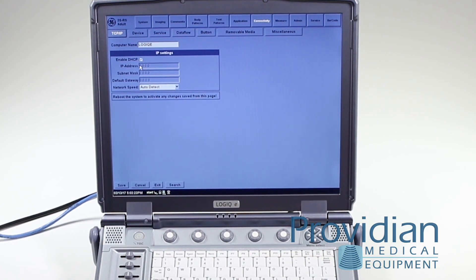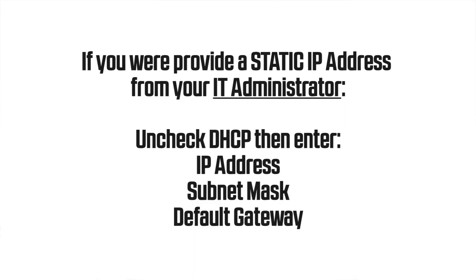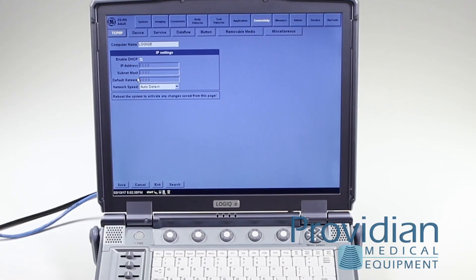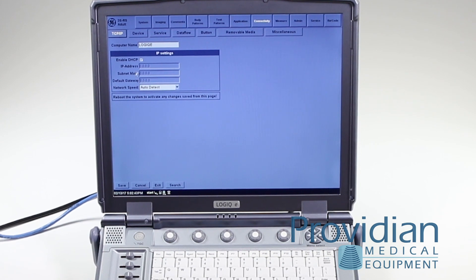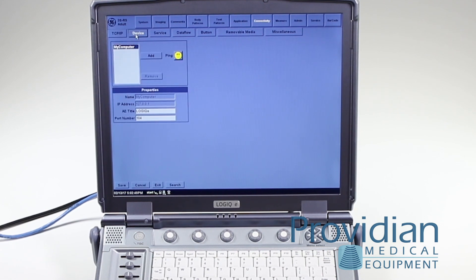Otherwise, you'll need to enter your own IP address, subnet mask, and default gateway provided by your IT person — only someone familiar with your router can give you that information. Also make sure there's no firewall blocking outgoing traffic from the ultrasound machine in the DICOM format. If you make any changes here, you will have to reboot the system. Hopefully you just have DHCP and can get on the network and move on to step two.